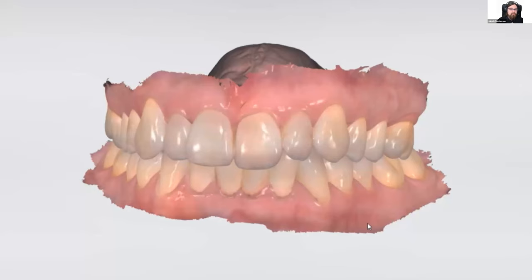Of course, that can give you quite usable results. Typically, what I tend to say with all kinds of software, and that's true for the 3Shape scanning software as well as our PreForm software, which I'm going to show you later, is that every minute you take for a little bit of a nicer preparation can multiply itself into the post-processing that you will have to do. So skimping on the scanning process and not doing it properly, leaving a lot of holes in, will give you a result that has way higher tolerances than what you want to have in the end. And it will also give you much more difficulty in post-processing and fixing those holes that you left in. So take your time, practice it a little bit, and then you very quickly get the hang of it.